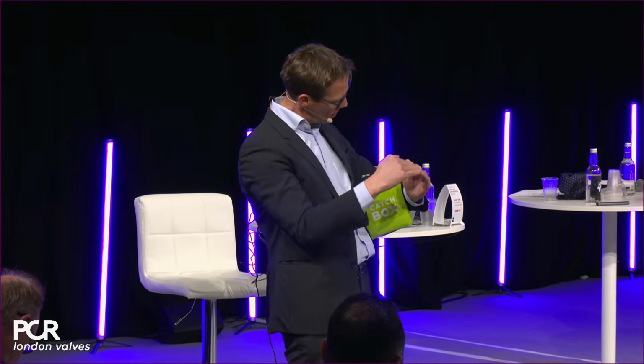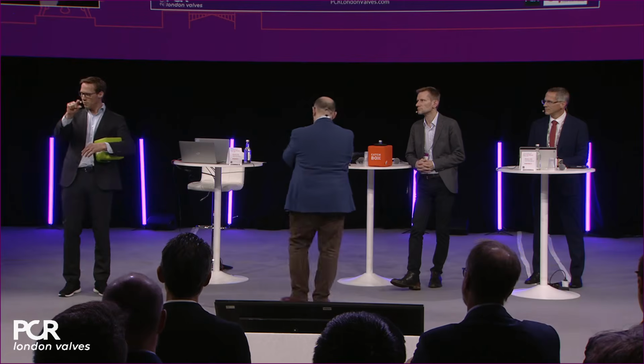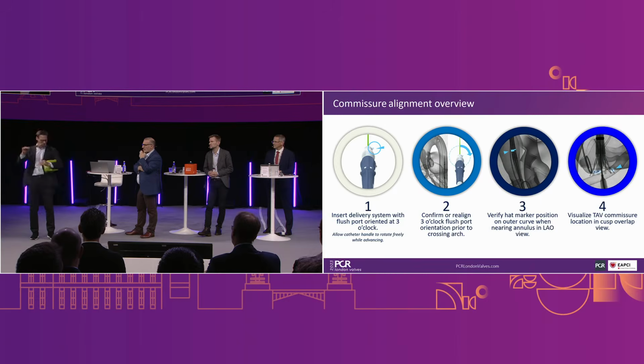So I think I have to relearn what 3 millimeters is, because the dots now show me the 3 millimeters. I've got to relearn to get those dots at 0 rather than underneath, because I'm used to getting a bit of the valve frame underneath and I'm happy. Now I'm getting the dots underneath, but I don't want that. I want the dots at 0, because that means I got 3 millimeter depth. I don't know, Stan, if you had that.